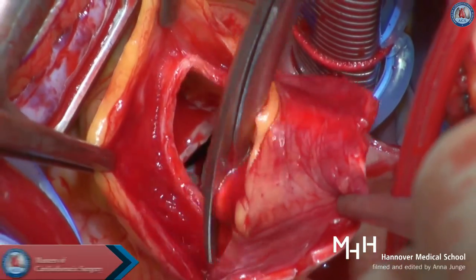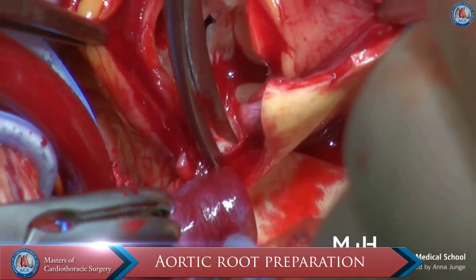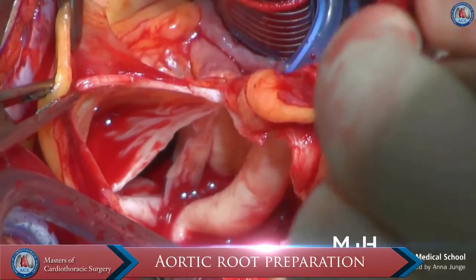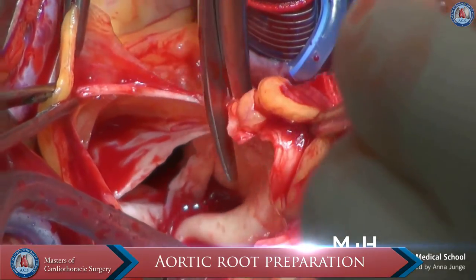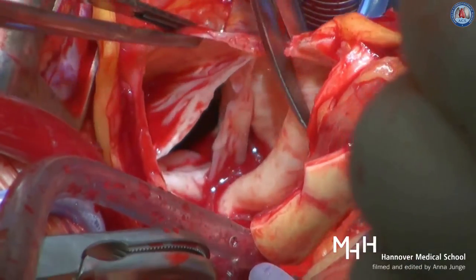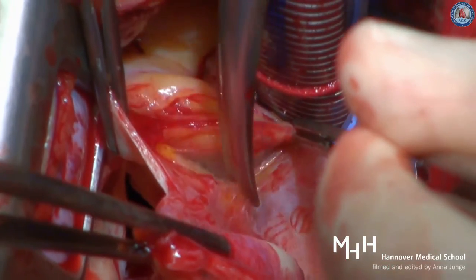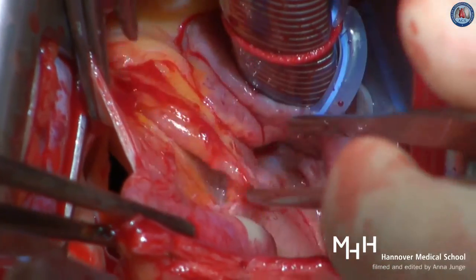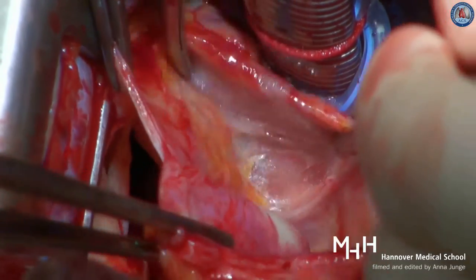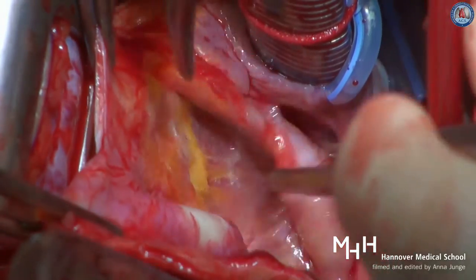The ascending aorta is transected directly above the commissures and the aortic valve is assessed. The aortic root is mobilized from outside to a level immediately below the nadir of the aortic annulus. Small vessels are meticulously cauterized during aortic root preparation. Care is taken to ensure absolute hemostasis at every step of the operation.